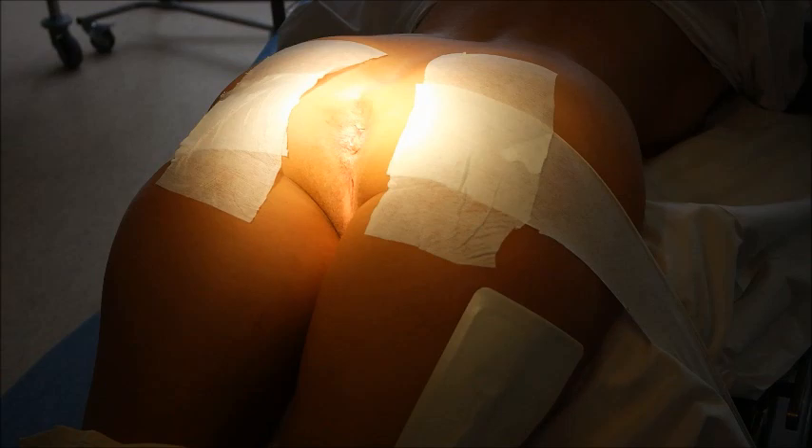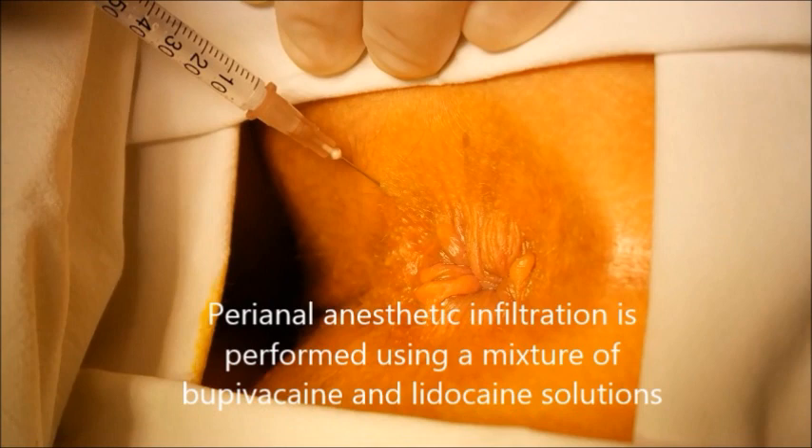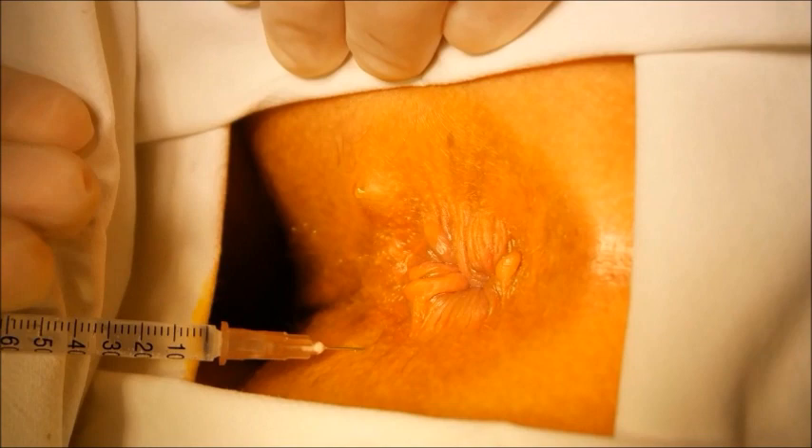Patient is placed in a prone jack-knife position. Surgical field is prepared with povidone-iodine solution. Perianal anesthetic infiltration is performed using a mixture of bupivacaine and lidocaine solutions.